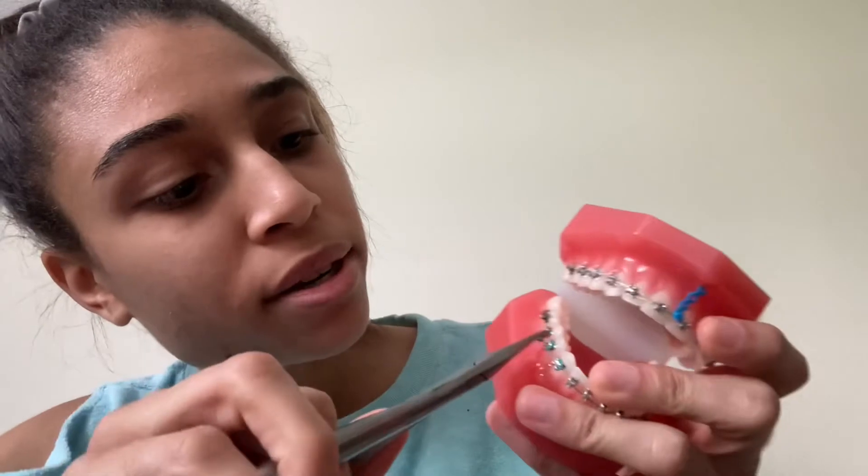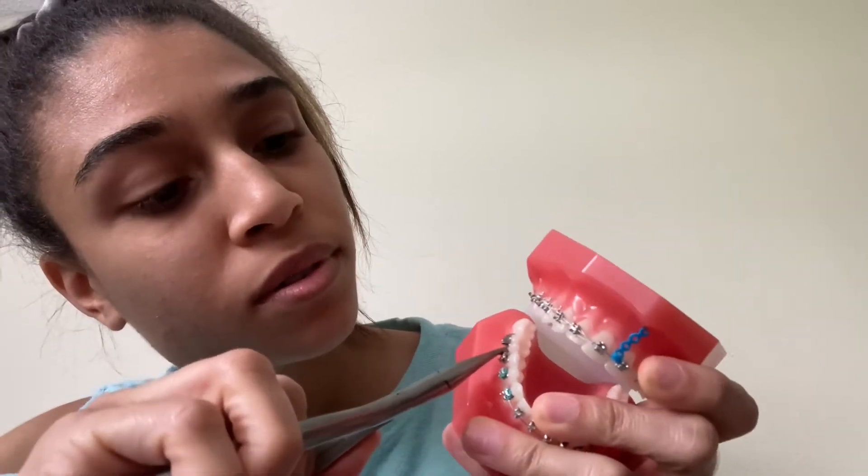This is a How plier — you can call it a Weingart, people call it different things. This is used for many things but mostly wires — putting the wires in the bracket tubes, taking them out, doing all that fun stuff.